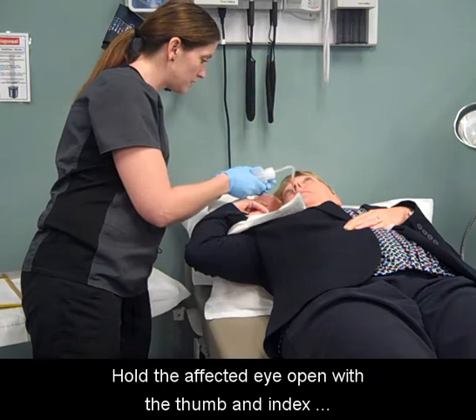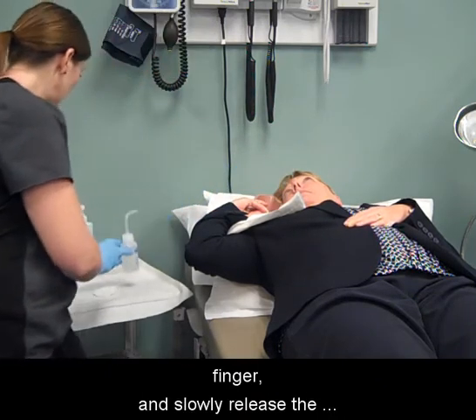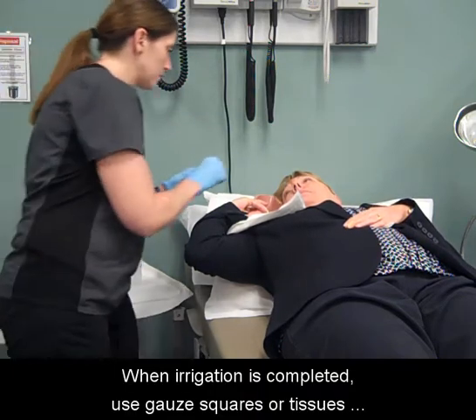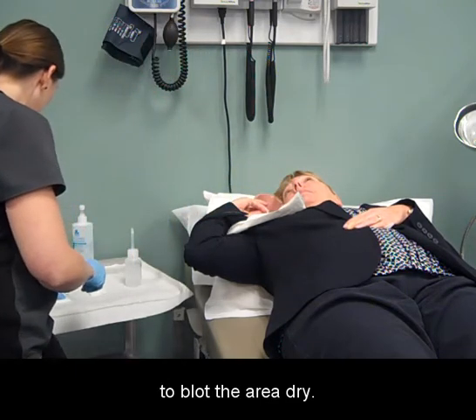Hold the affected eye open with the thumb and index finger and slowly release the solution over the eye gently and steadily. When irrigation is completed, use gauze squares or tissues to blot the area dry.